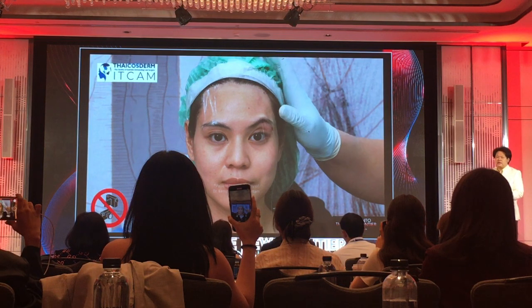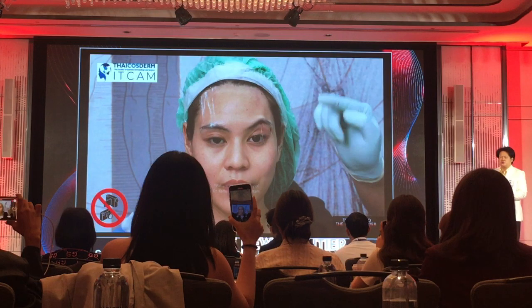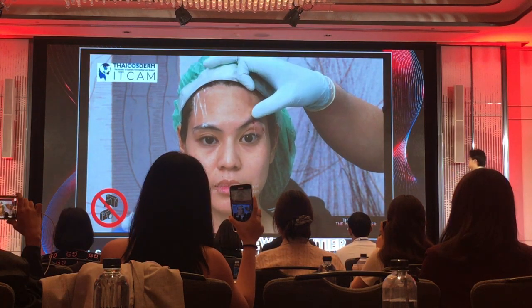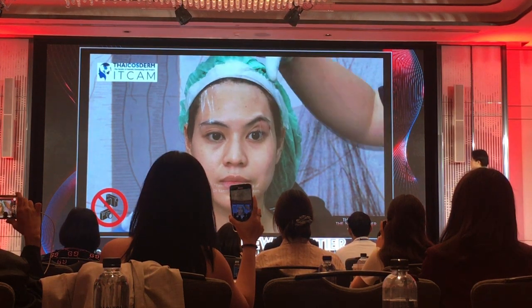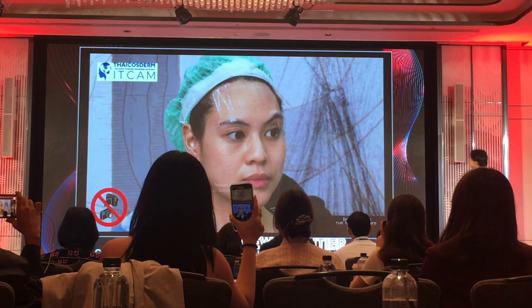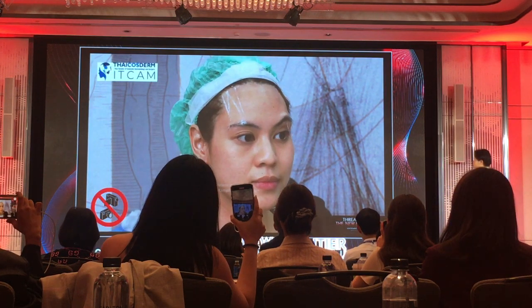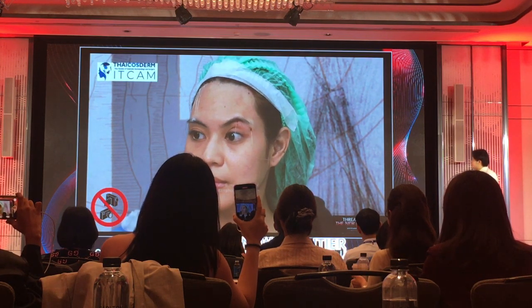And I would recommend that you should traction very high, above the superciliary arch or the orbital ring. That's what we need. And then we just cut the thread. And we also do the same thing for both sides. You will see that it's very smooth. There is no thread that could be visible if you are in the deep plane.